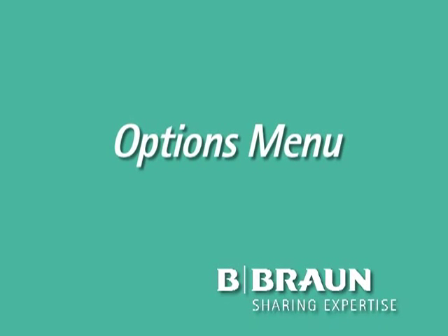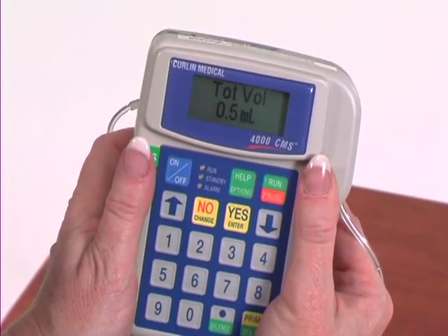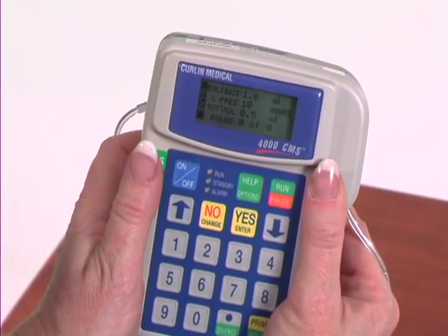We have gone over programming a new program, changing the program and hanging a new bag, and using the same prescription. Everything else you would like to do with the pump is found on the Options menu. Let's assume that you want to give a clinician bolus. Note that the pump does not have to be paused to give a clinician dose.